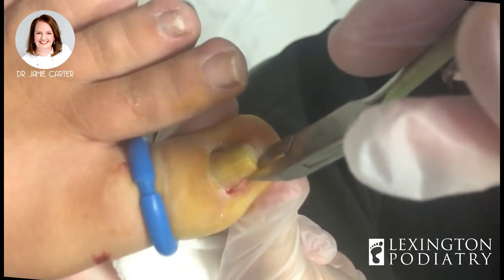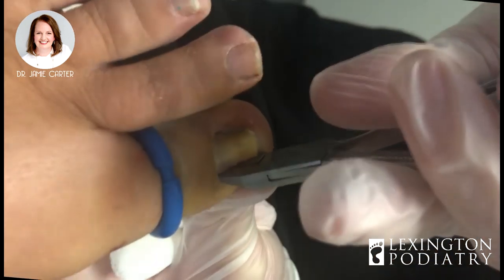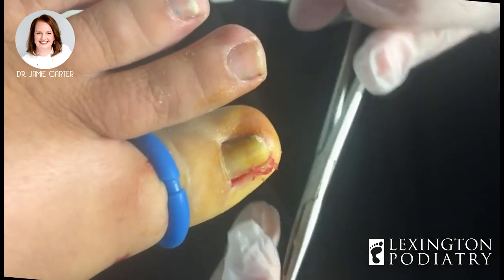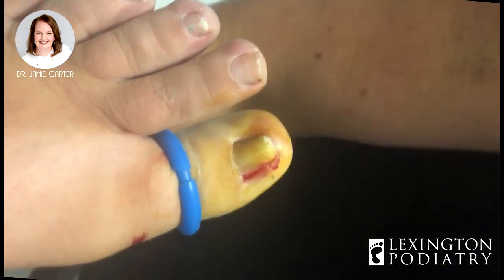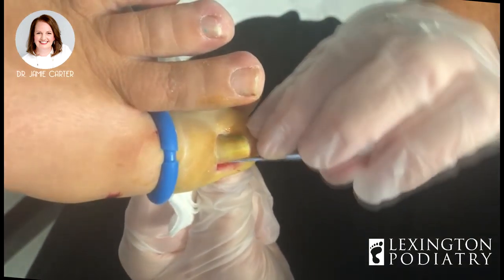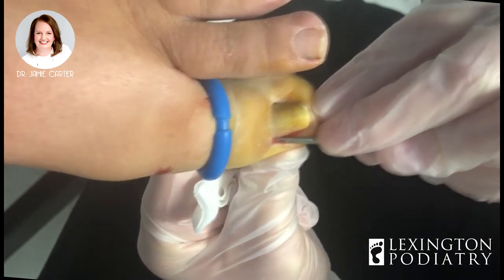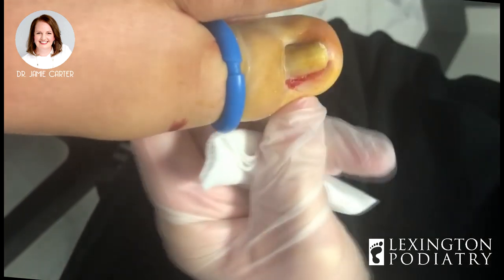I don't want to take a huge section because she's already had toenails removed before, so I don't want her to have just a little tiny sliver of nail left. There's obviously a root there. We're going to clean it up a little bit — there's definitely some hardened skin and tissue in there that I'll get out. I'm going to square this off just a little bit more. Going underneath the cuticle there.